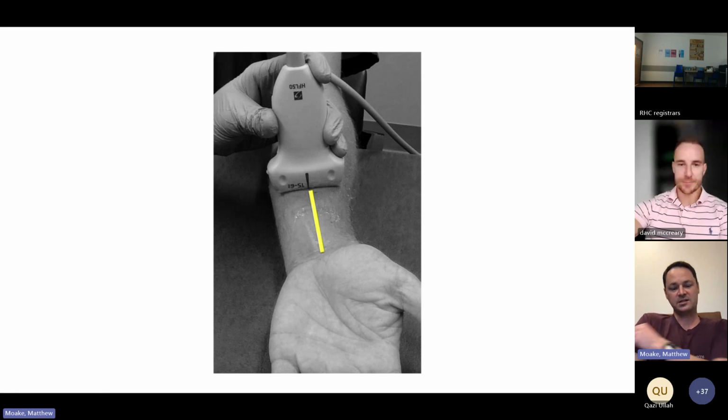The key with that tracking is that the nerve and the tendons within the wrist often look pretty similar. And so tracking them helps you differentiate. The nerve will stay fairly consistent in appearance and will often, as you come up, separate itself from those tendons, whereas the tendons distally will look like tendons, and as you move proximally, they'll transition into more muscle tissue and go through the aponeuroses, and then you can differentiate the two.